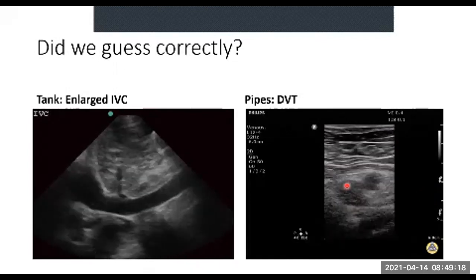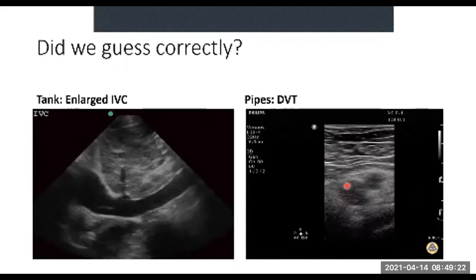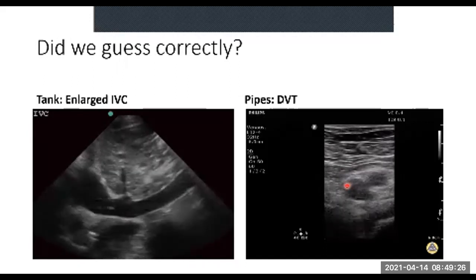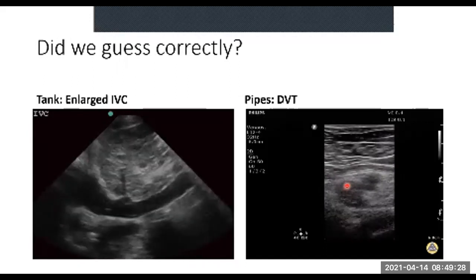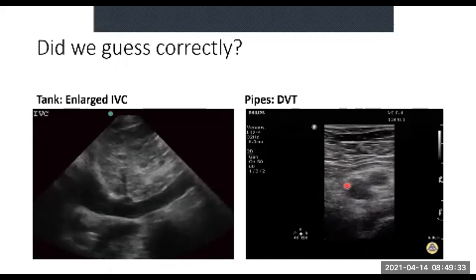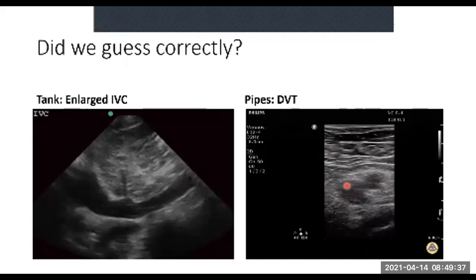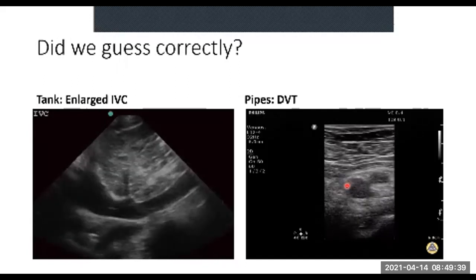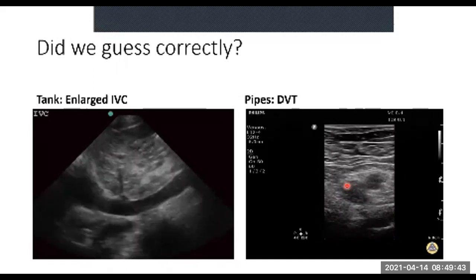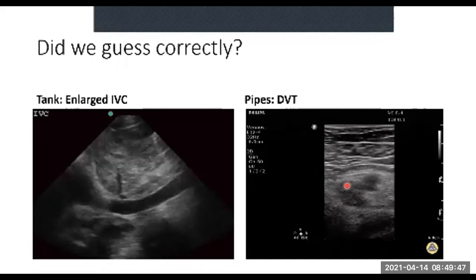And by the same token, if you have a patient in hypovolemic shock and you're giving them fluids, you can monitor their response. You can look at their heart, you can look at their IVC, look at their BPs, see if it's improving. You've got a patient with neurogenic shock or septic shock, you know you've got to start antibiotics, you've got to start vasopressors. You can put them on fluids, there's no problem, it will help. But at the end of the day, you know in which direction you need to go. You've got a patient with a pulmonary embolus, it's no use stuffing them full of fluids, you need to get them thrombolized. So this is where it helps.